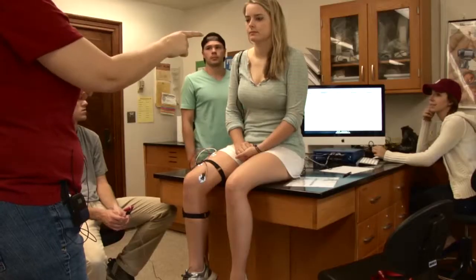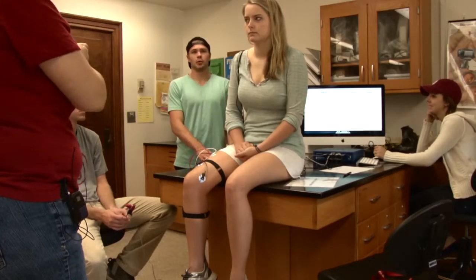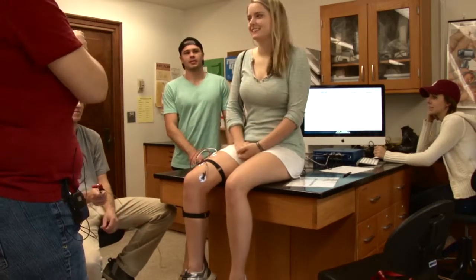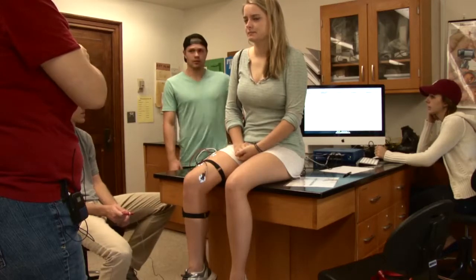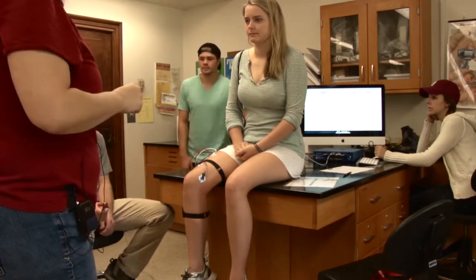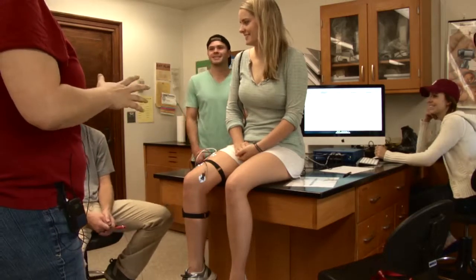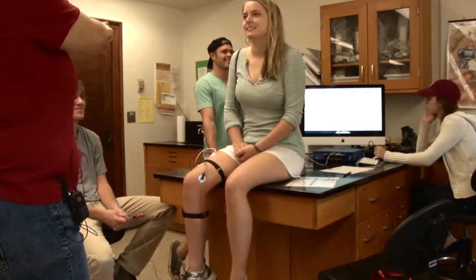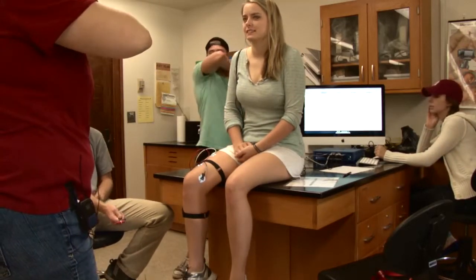Just real quick, you're going to press start. I'm going to say pull. What are you going to do in response? Pull really hard. When do you tell her to relax? After the first peak of the goniometer. Right, after it starts to come down. And what's your job as the striker? Strike. When? After he says pull. Yeah, immediately after you see her, not just when he says pull, but when you see her tighten.